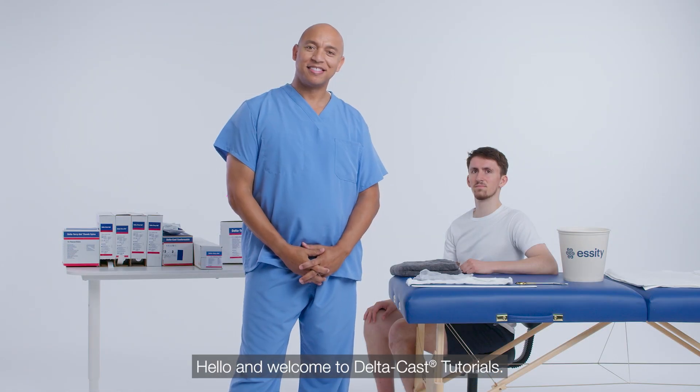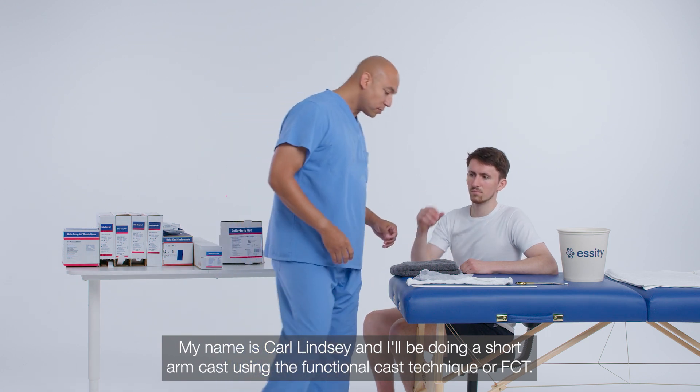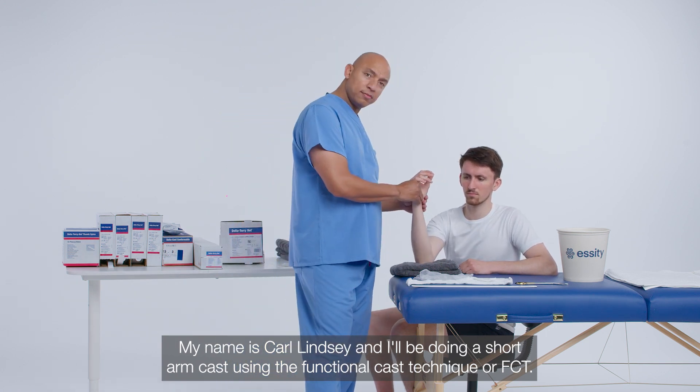Hello and welcome to Delta Cast Tutorials. My name is Carl Lindsey, and I'll be doing a short arm cast using the functional cast technique, or FCT.